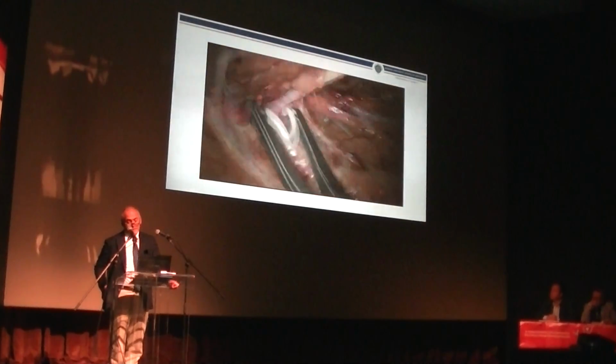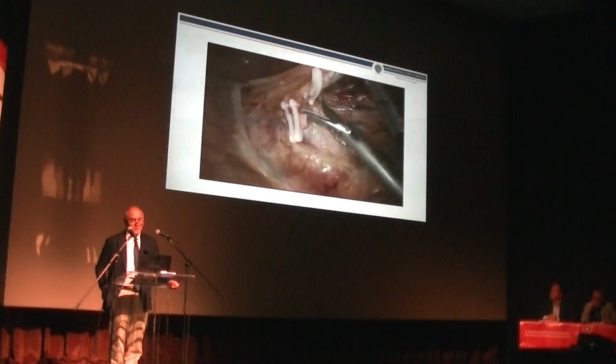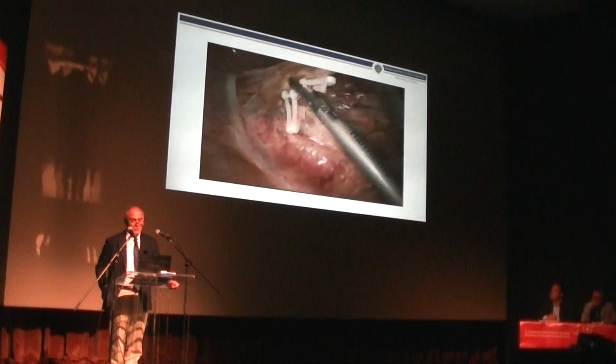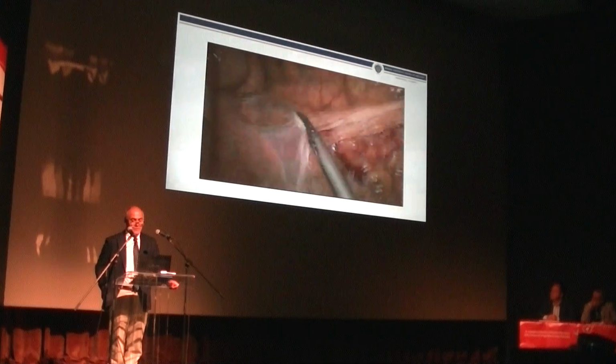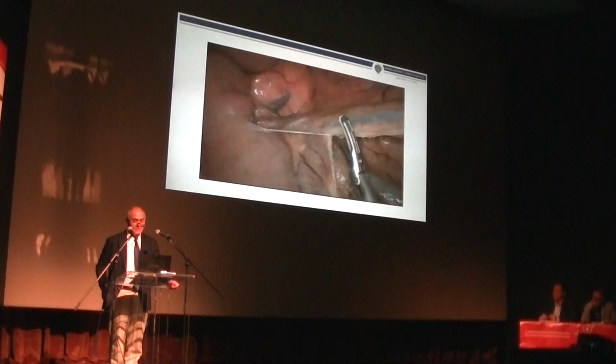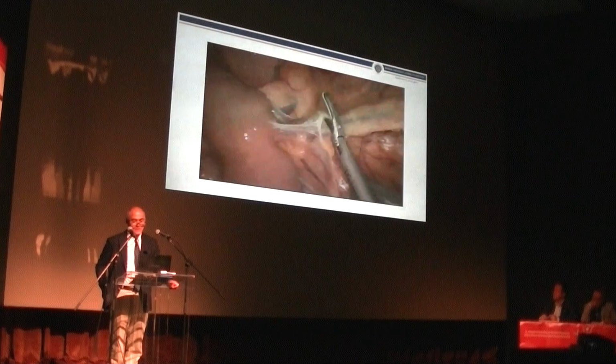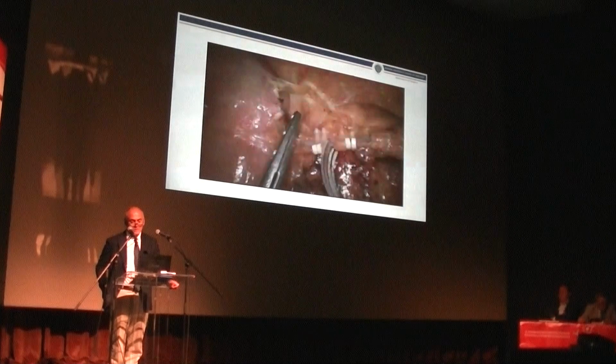And in the live surgery, this is the inferior mesenteric artery. We are protecting the autonomic nerve. We are following the duodenojejunal junction, and we reach the inferior mesenteric vein. Just be aware that there are mesenteric communications. This is another patient.